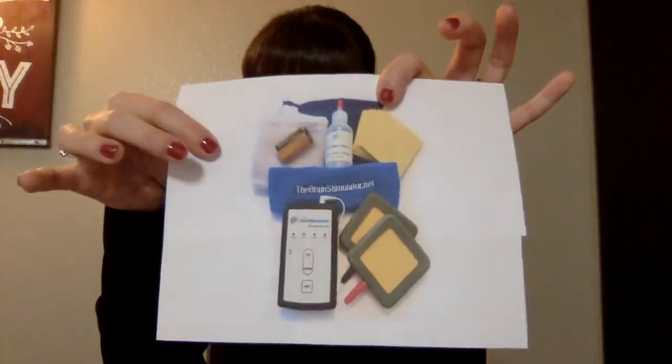And the green and red buttons for your client to respond. Again, I'll go over that in a bit. For now, I'm going to go over setting up the tDCS device, which again is all of these materials.